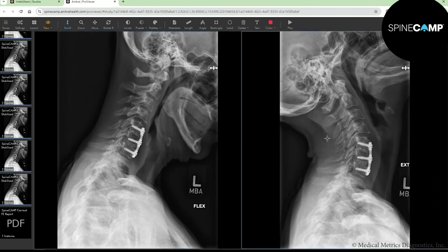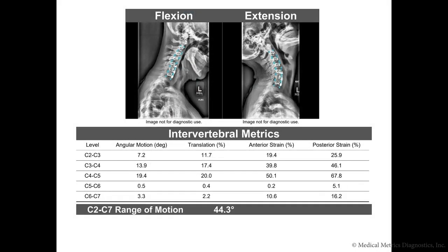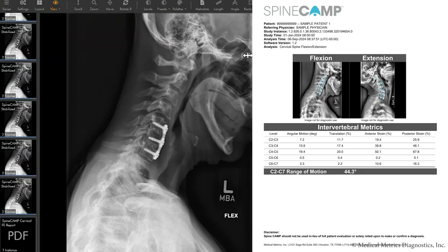Clicking on the EFE report in the right view pane, we can visualize the angular motion and strain required to apply the protocol. Looking at the data for C5-C6 across that row, we can see there is half a degree of angular motion, 0.2% strain at the anterior margin, and 5.1% strain at the posterior margin. Since strain is greater than 5%, we need to consult the stabilized imaging to make our final diagnosis.